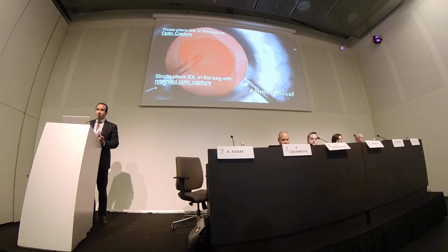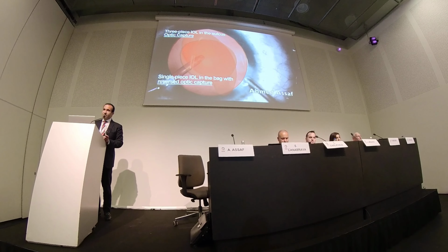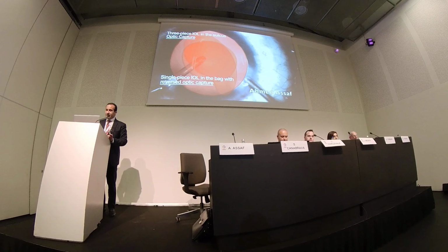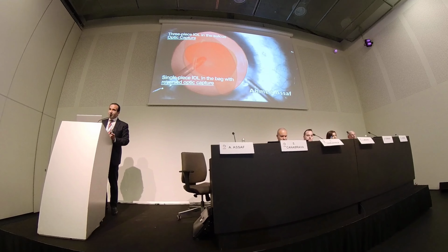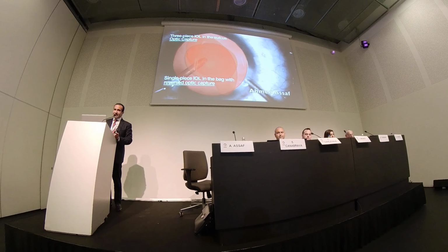Or if you have a large break like this, the safest is to implant a 3-piece IOL in the sulcus and do optic capture if you have an intact rhexis, or you can implant a single piece lens, and we are experienced with the reverse optic capture.